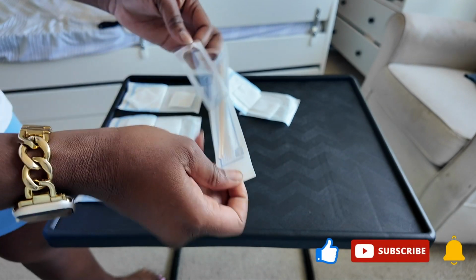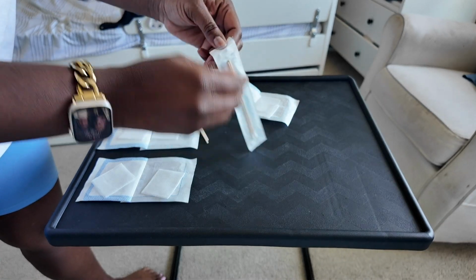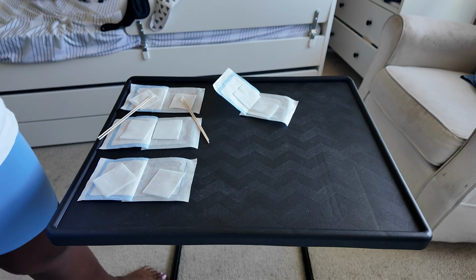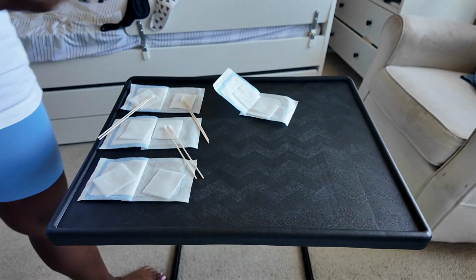So these Q-tips can be used for other things, but these are mainly our Q-tips for trach care. We also use them for G-tube cleaning and G-tube cream application. What you'll see too is that they're like your standard Q-tips that you would clean your ears with, but they're a little bit longer, so there's a longer handle so we can really get around her stoma.